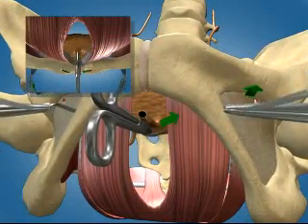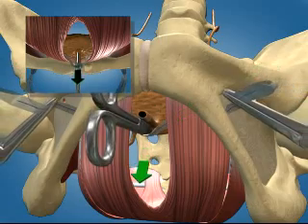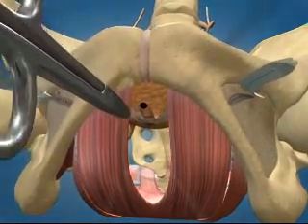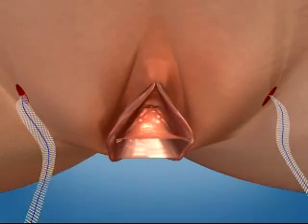Position the mesh under the urethra without tension. The tensioning suture allows for intraoperative tension refinement without mesh distortion, as well as postoperative position adjustment. Once positioning is achieved, remove the plastic sheaths.